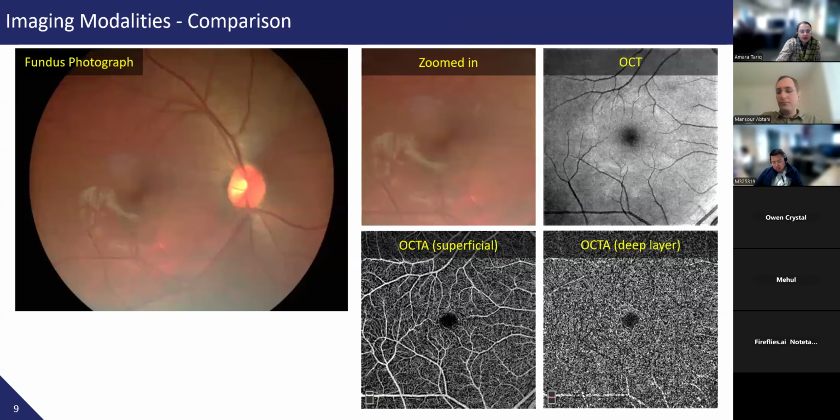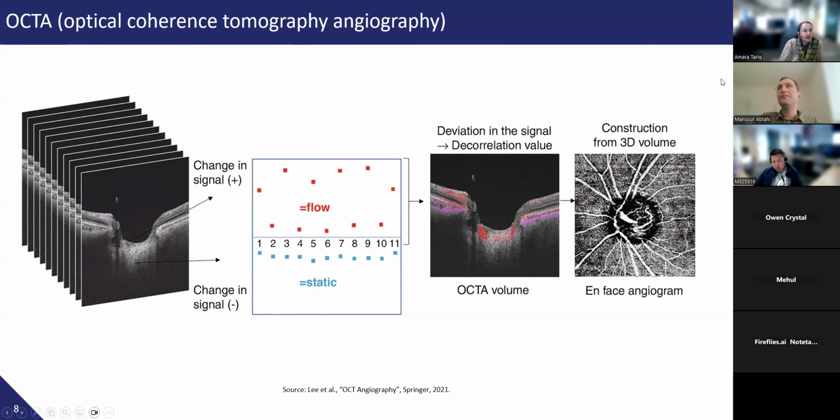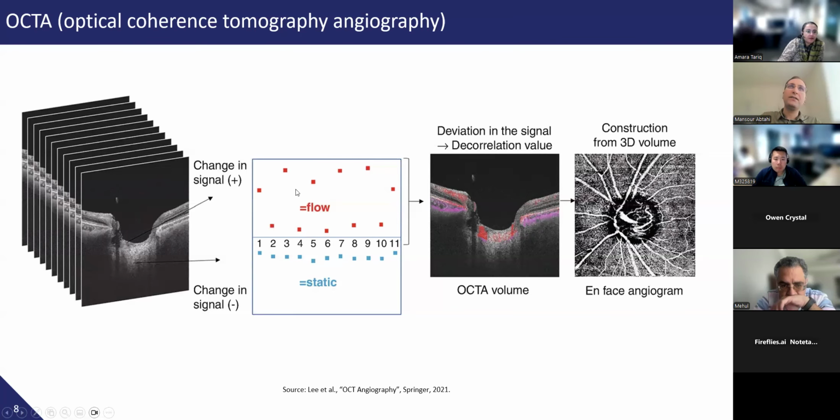Mansoor, can I stop you right here? Sure. If you can go back? So what do you mean by variation? Is it like spatial variation, like as you're scanning? Standard deviation of this signal that you can see. In different scans at the same location, at every point the intensity has a variation. We can calculate the standard deviation of these variations.